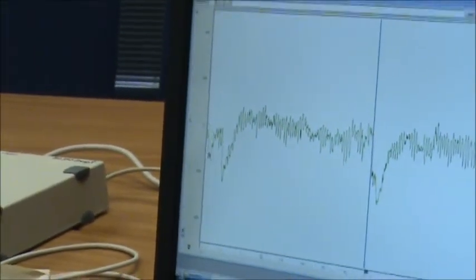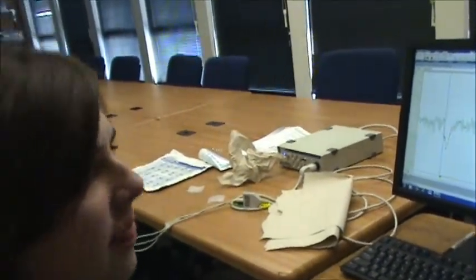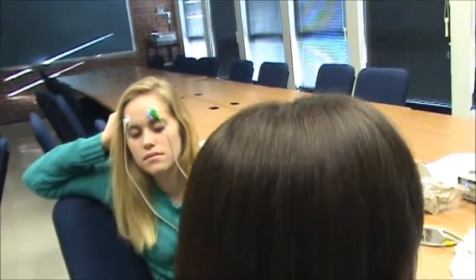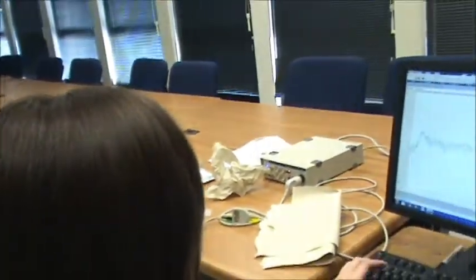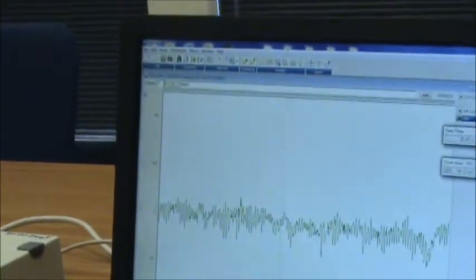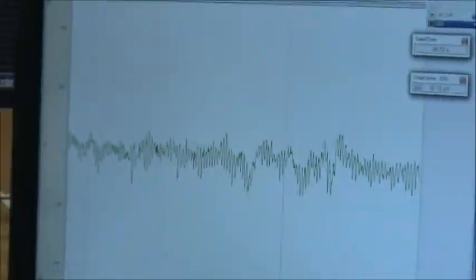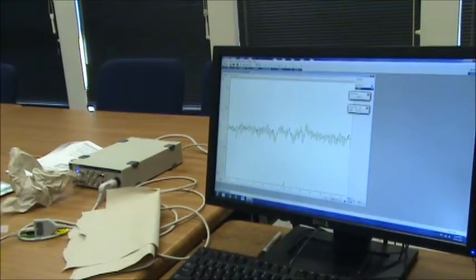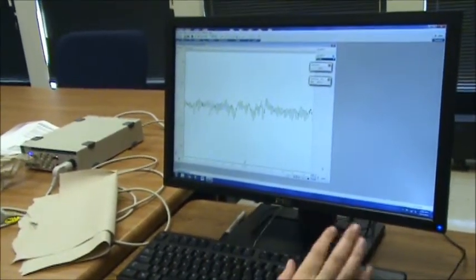Now while Ellen's in a relaxed state we're going to ask her to do some mental math problems. She's not going to answer out loud — in this relaxed state she's just going to think the answer in her head. We're also going to type 'math' before we ask the question. Okay Ellen, what's three times four? What's five times three? It's good to stop the EEG in between these sections so that it gives a clear distinction between each part.